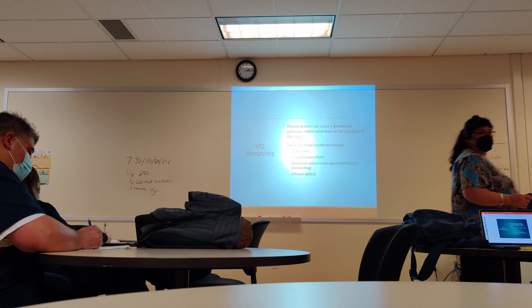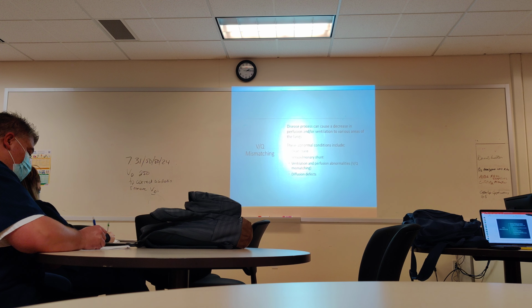Is there a specific amount that we have to take out? No. If they give it to you, take it away. It doesn't matter if it's 150, 250, 450, who cares, just throw it out. Get rid of it.